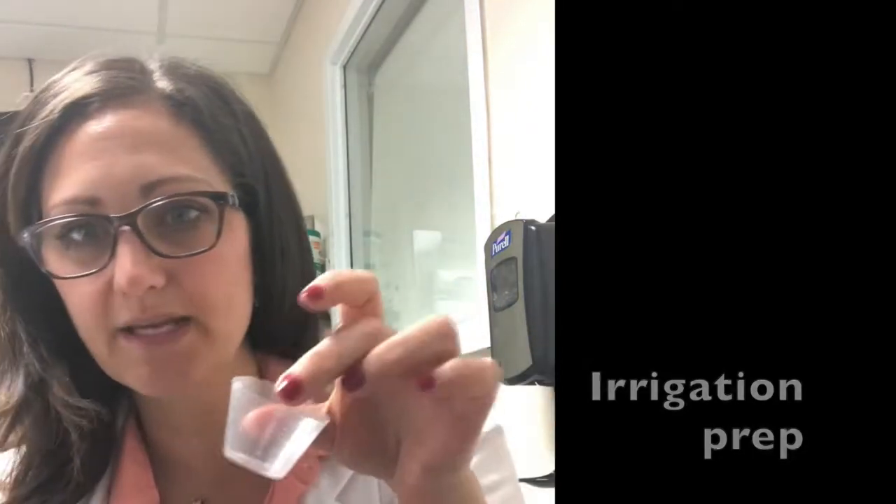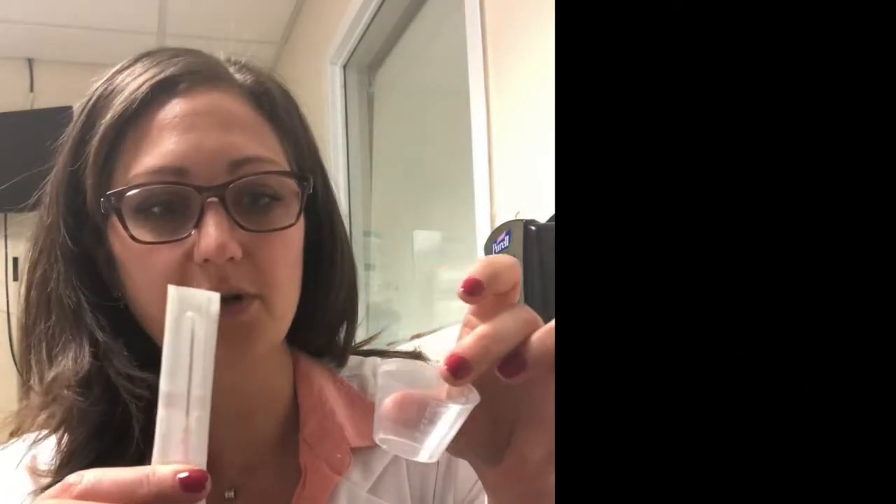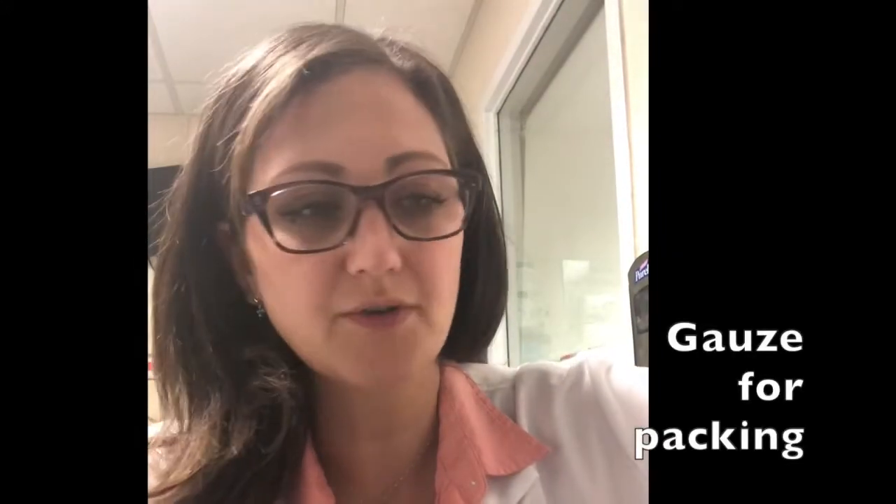You're also going to need a little medicine cup and a needle to draw up your medication, as well as a 10 ml syringe. I also like to keep some 2x2s on hand for the packing, and occasionally also some 4x4s, which we will need for some of those bigger sized nostrils.